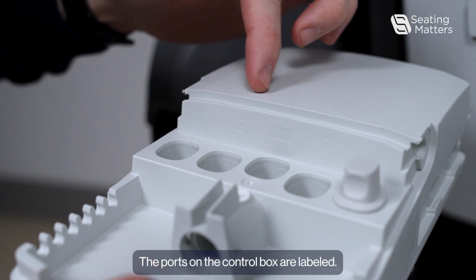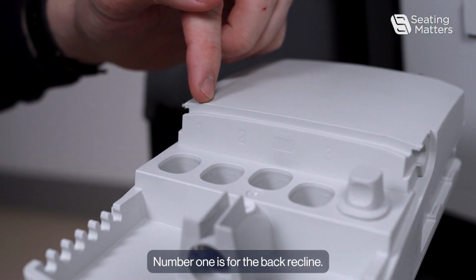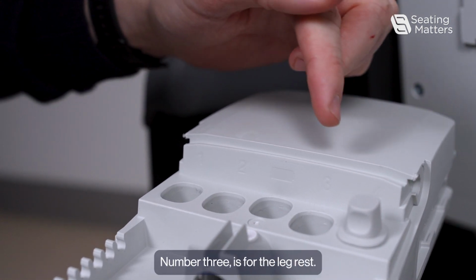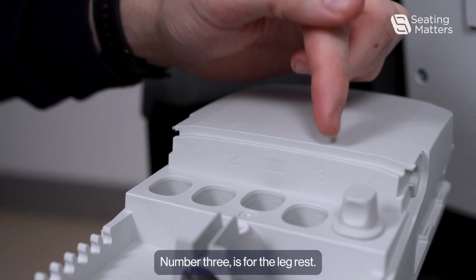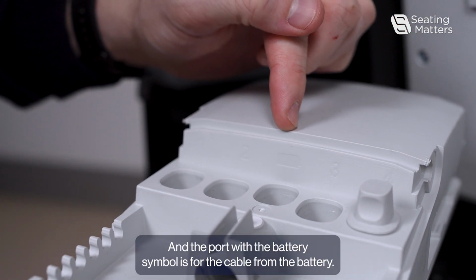The ports on the control box are labelled. Number 1 is for the back recline. Number 2 is for the tilt. Number 3 is for the leg rest. And the port with the battery symbol is for the cable from the battery.